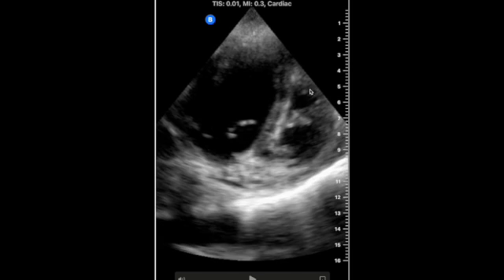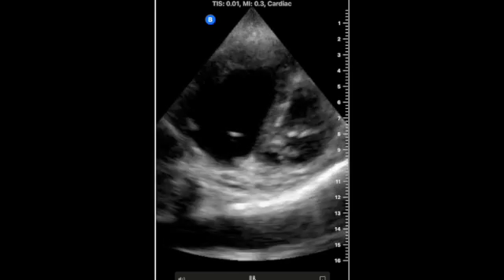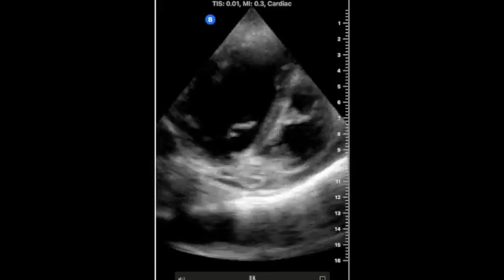You see, this is what we call D'ing of the left ventricle. You can really make the outline of the D right here. What happens is the right ventricle is seeing an incredible amount of pressure from the pulmonary artery, and as a result, from the lungs and the pulmonary vasculature, the back pressure is causing the septum to push into the left ventricle. You can really see that.